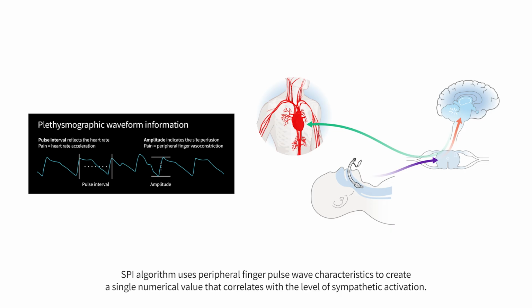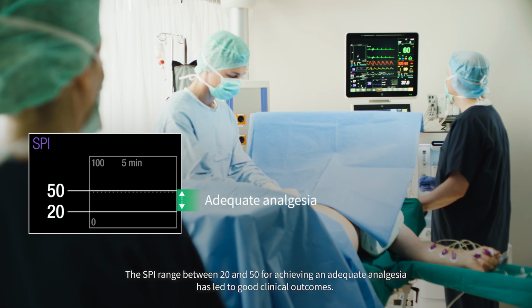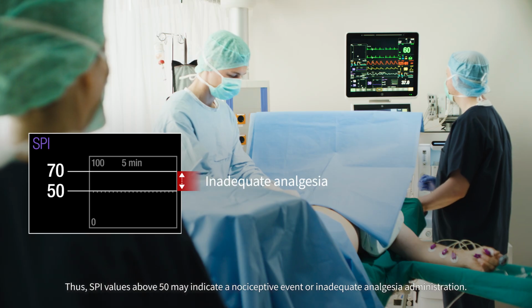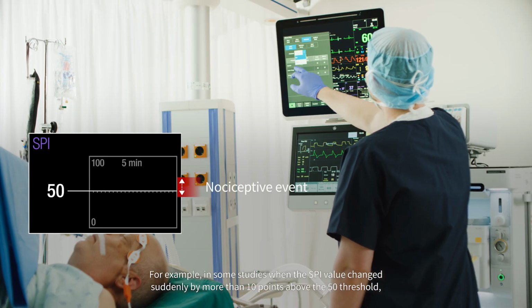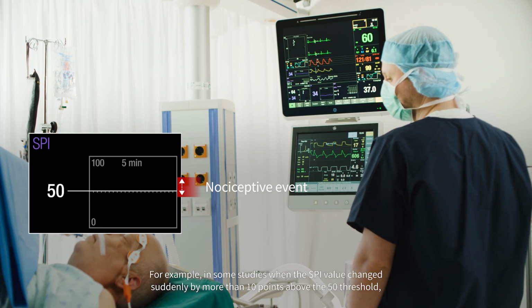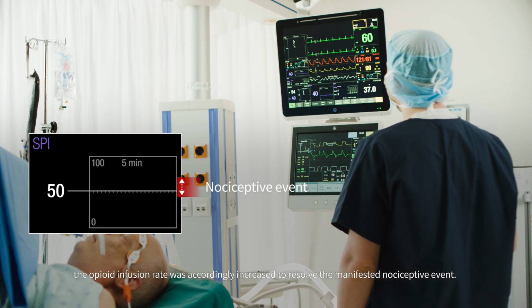The SPI algorithm uses peripheral finger pulse wave characteristics to create a single numerical value that correlates with the level of sympathetic activation. The SPI range between 20 and 50 for achieving an adequate analgesia has led to good clinical outcomes. Thus, SPI values above 50 may indicate a nociceptive event or inadequate analgesia administration. For example, in some studies, when the SPI value changed suddenly by more than 10 points above the 50 threshold, the opioid infusion rate was accordingly increased to resolve the manifested nociceptive event.